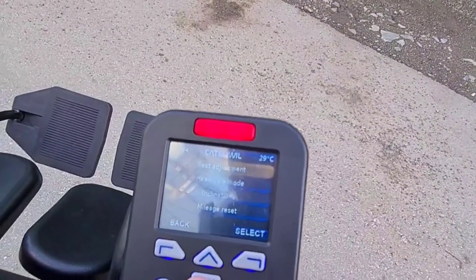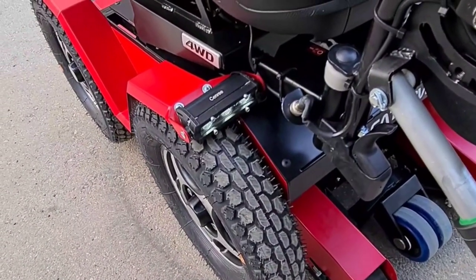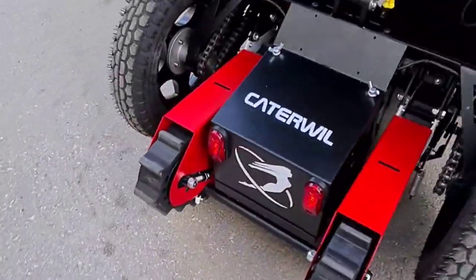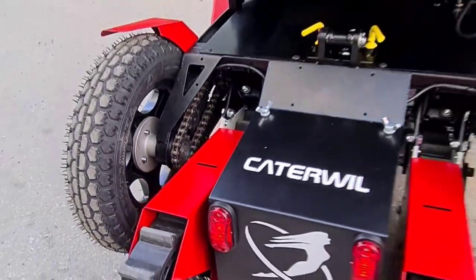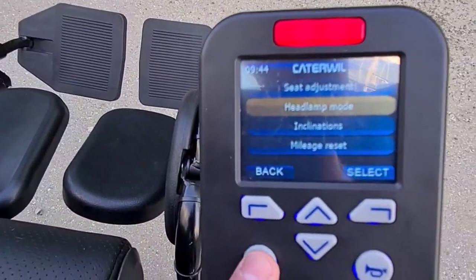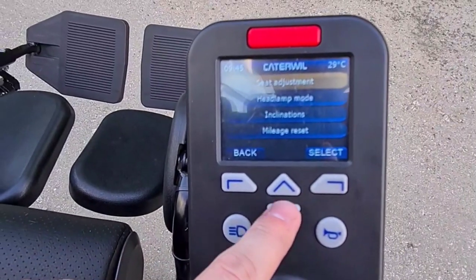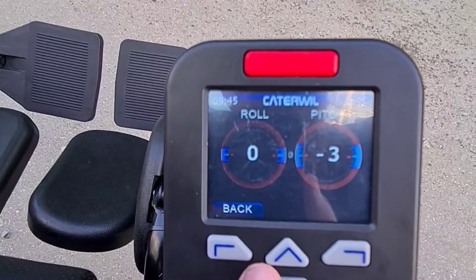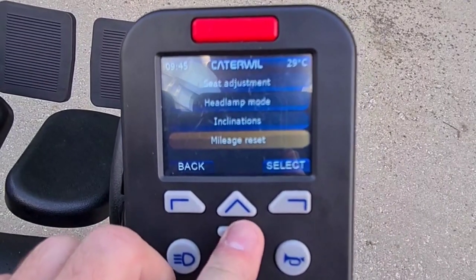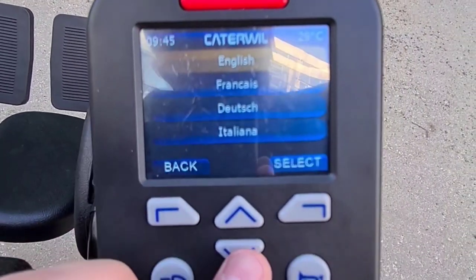Inclinations. Lamp mode — this is a lamp mode. And this is an alarm mode — you can also switch it with a button, there is a special button for this. Inclinations — this is the inclination of the wheelchair; you need it when you climb stairs. Light brightness, sound settings, error information, language — there are different languages.